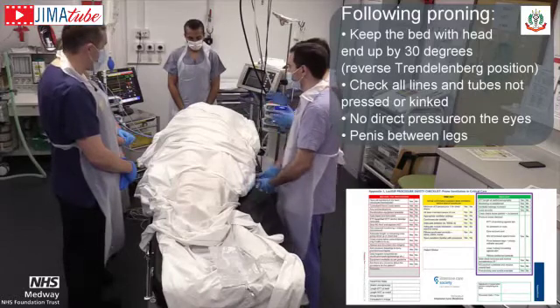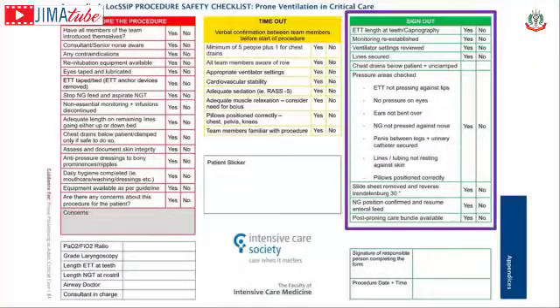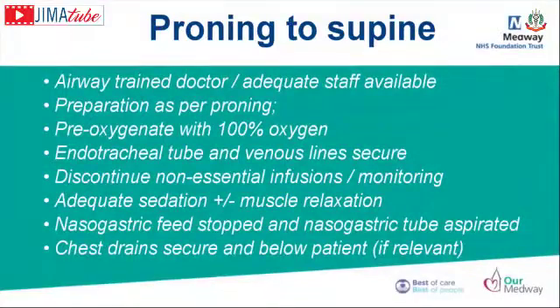So that concludes the proning part of the exercise. This demonstration has been done without specialist equipment like head frames, and also without too much movement of the equipment, as during the pandemic units with various resources and size may have to implement this exercise, and it may not be possible for them to have all specialist equipment or large space during the procedure.